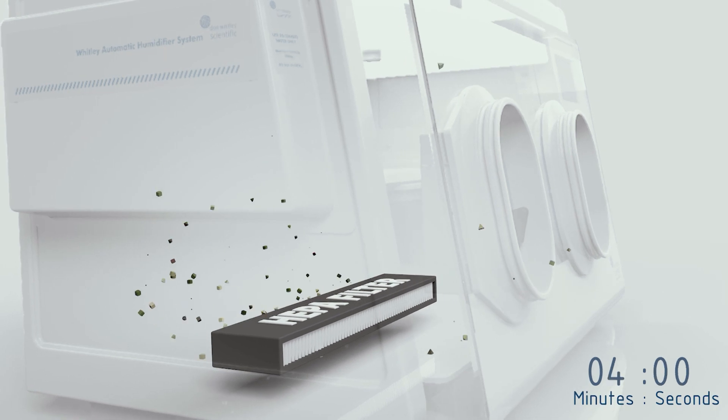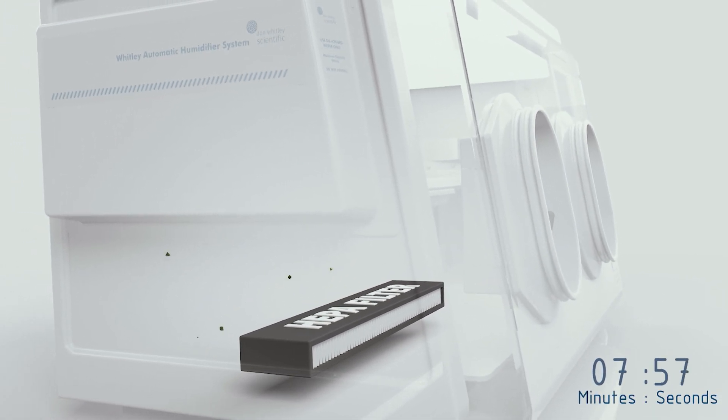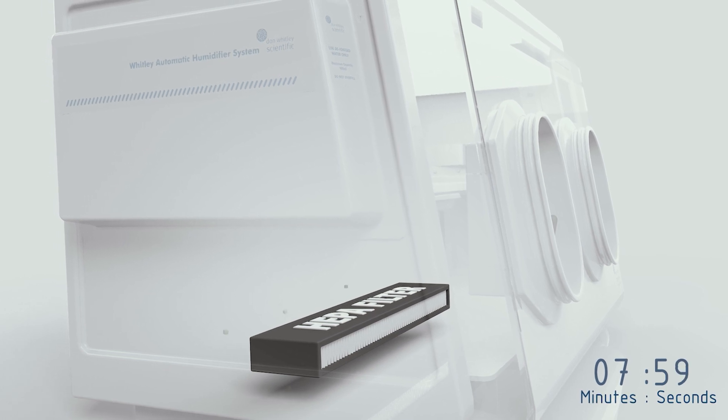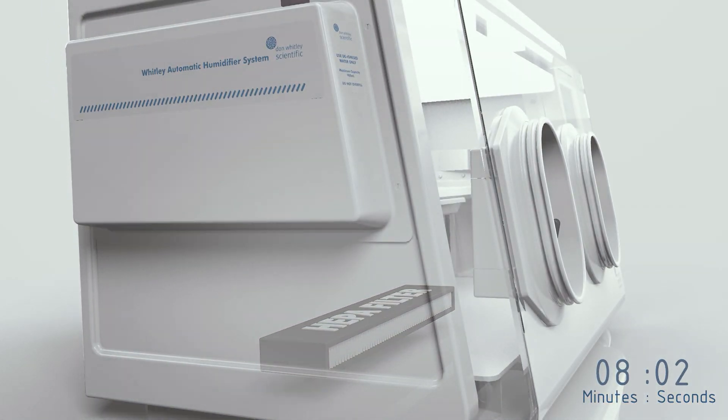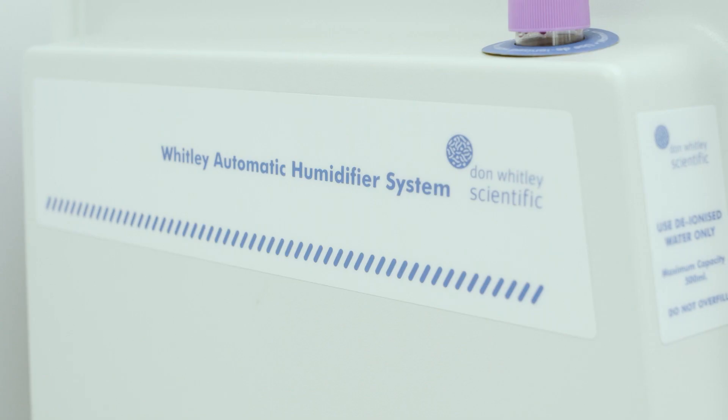The entire workstation atmosphere passes through the filter hundreds of times an hour which ensures the chamber environment is cleaned quickly. The filter location inside the workstation prevents it from becoming saturated with moisture.